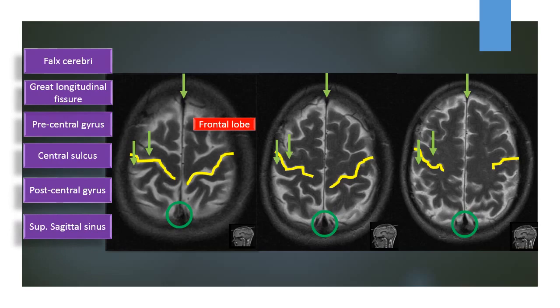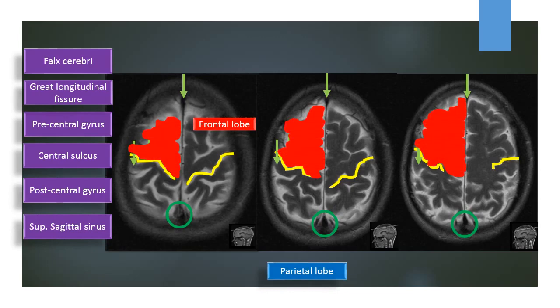The frontal lobe is located in front of the central sulcus, and the parietal lobe is located behind the central sulcus.